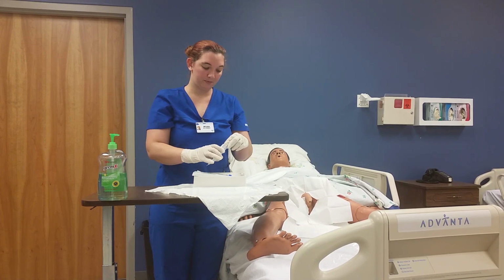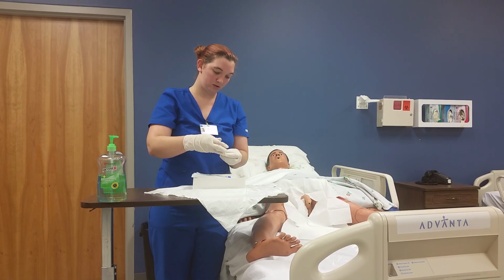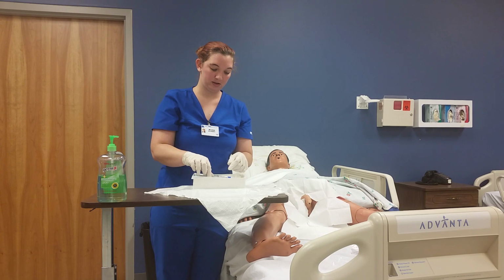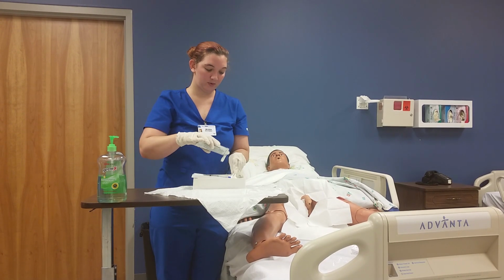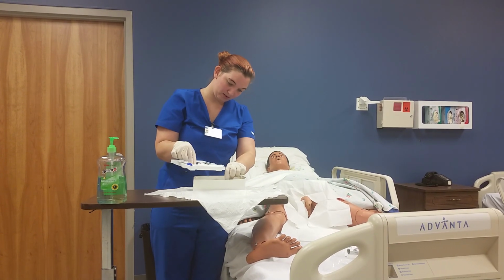I'm going to take my swabs here. I'm going to open these up. Place them here. I'm going to place these in my bag down there, so I don't need them. And open up these swabs, place them here. Throw those in our trash bag. I'm going to take this out just a little bit.